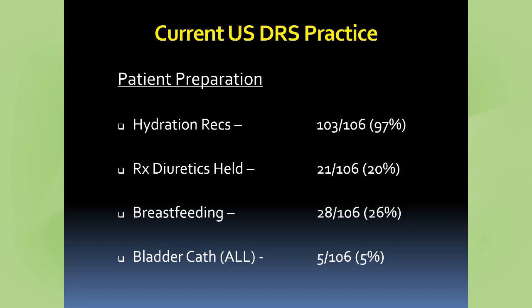Now, I emphasize this is based upon protocols as well as review of reports. Certainly, if you have a very astute technologist or administrator who's reaching out to a patient, they may be telling them this. It just may not be in the protocol. So we are a little bit limited in that the actual practice may vary somewhat from what's written in the protocols and documented in the reports, but we're only showing about 1/5 are compliant with that.